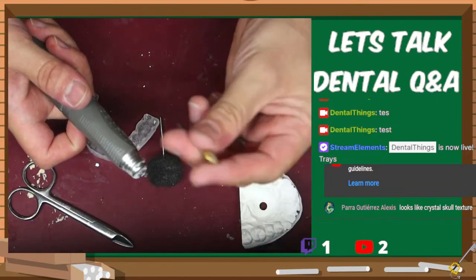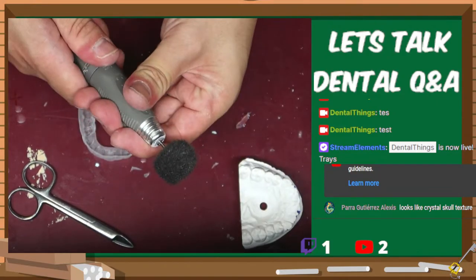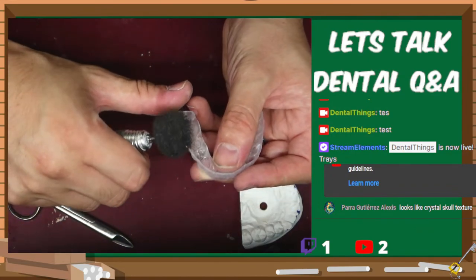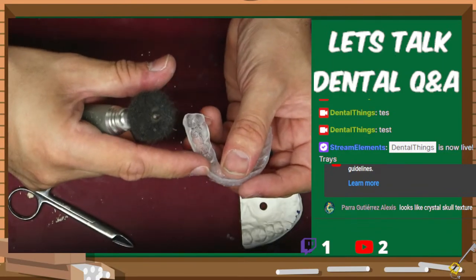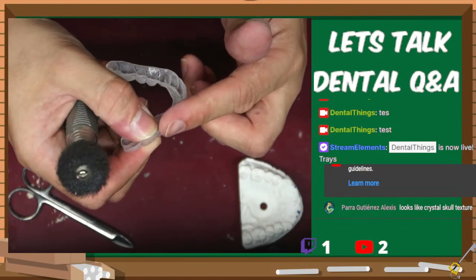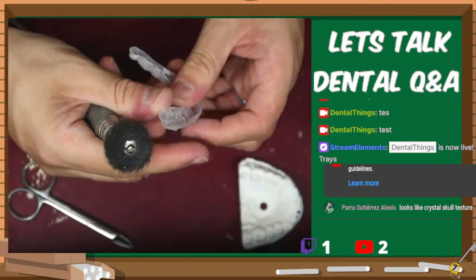I don't need this because this would be for trimming off parts of my model or whatever I'm trying to do it for. But I do need this part, lock it down, and now I can spin and get that to do its action. So now I just take it to this edge right here, and I'm just gonna make sure I just get the edge. Apart from just taking off some of the rough parts, it's also going to thin it a little bit, so it's a little bit more of an easy transition from your night guard to your teeth.